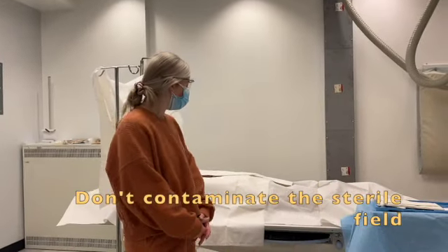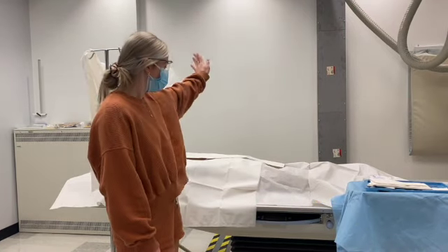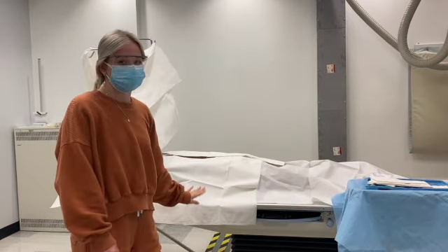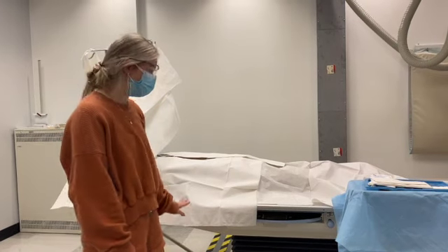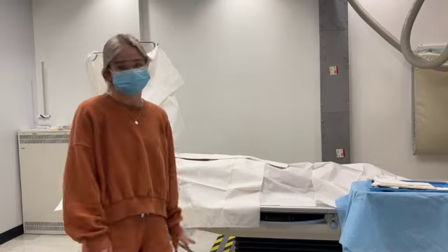The next rule is when you're using a C-arm, you must not contaminate the sterile field. So when you're moving from AP to lateral, you want to be careful that you don't touch the sterile drapes because that can contaminate it and you might have to restart the surgery and it's just dangerous for the patient.